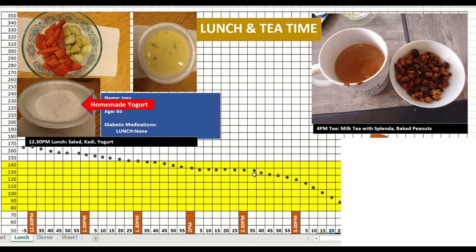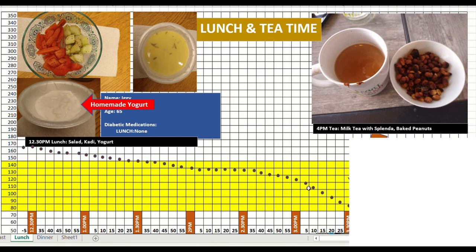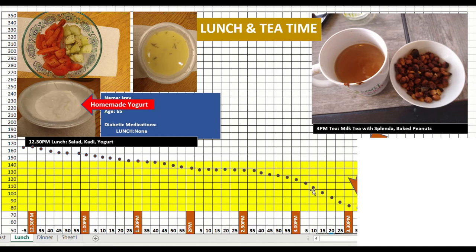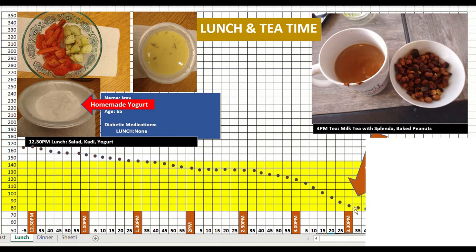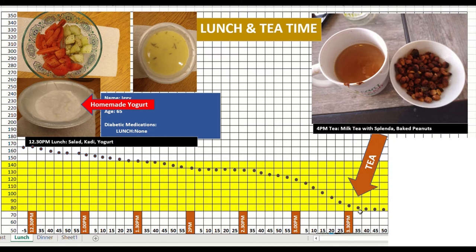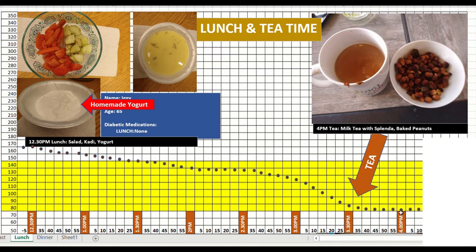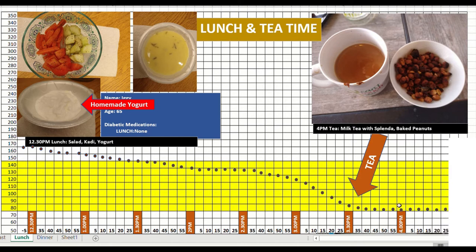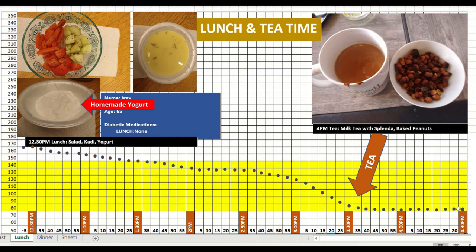It started coming down a little more aggressively, almost 1.1 point per minute, till it reached its lowest point around 3:30 when I had my tea. That day my tea was the regular milk tea with baked peanuts. And I stayed there, around 85, 83, 84, till 4:30.